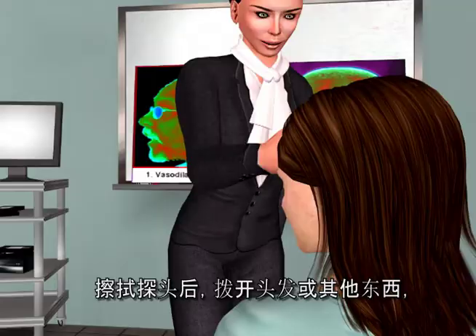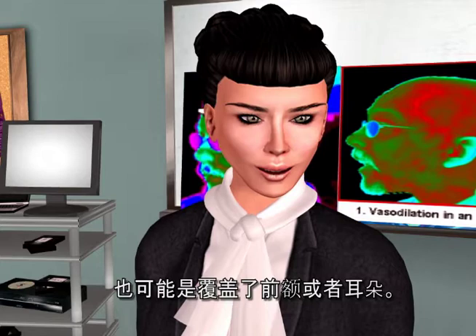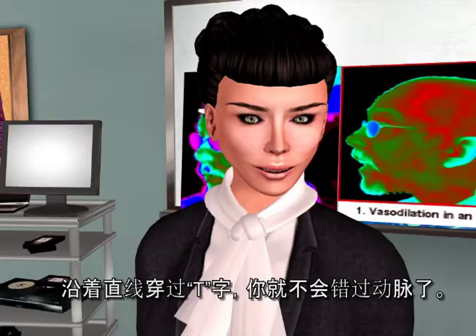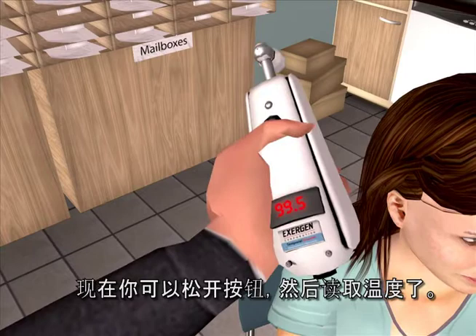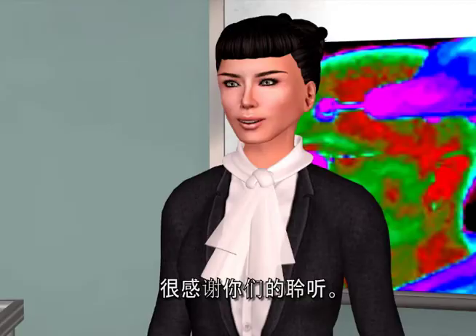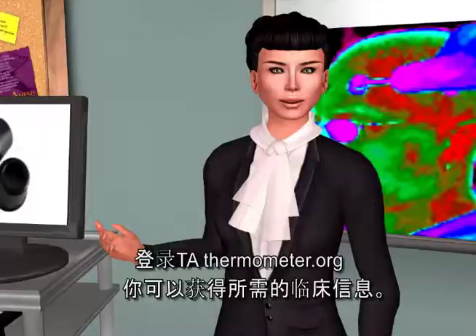After wiping the probe head, brush away any hair or anything else that might be covering the forehead or the ear. With the probe flush on the forehead, depress the button and keep it depressed until you are done. Slide straight across the forehead, crossing the T's — not down the side of the face. Continue to hold the button down, touch the neck behind the earlobe — the perfume spot. Let go of the button and read the temperature. The temporal scanner pinpoints the highest of 3,000 temperatures to provide the most accurate temperature possible. Please visit exogen.com for product information and TATthermometry.org for any clinical information you might need.